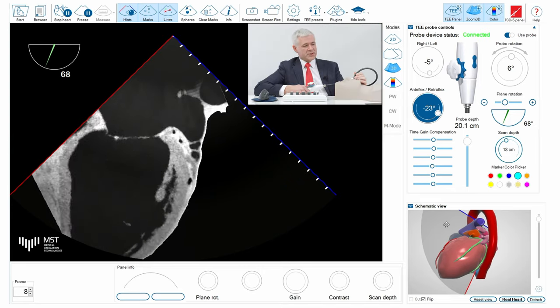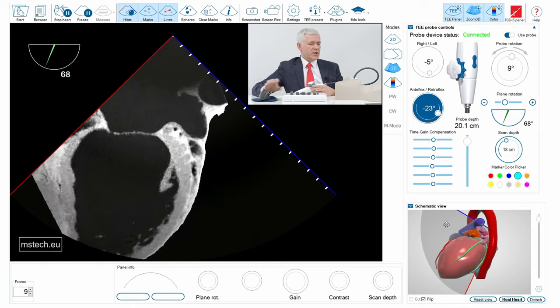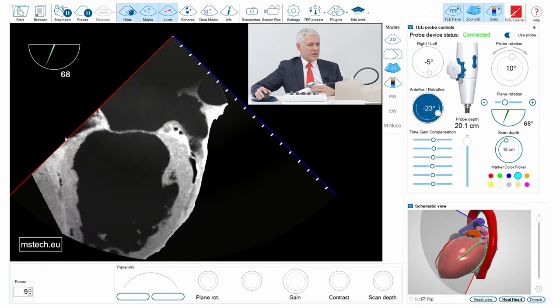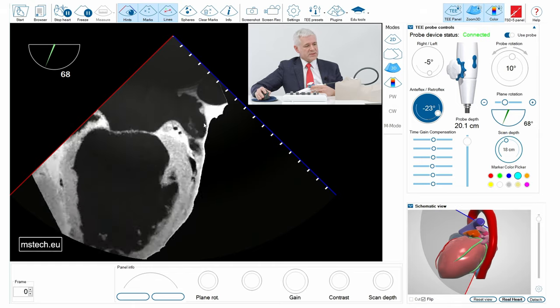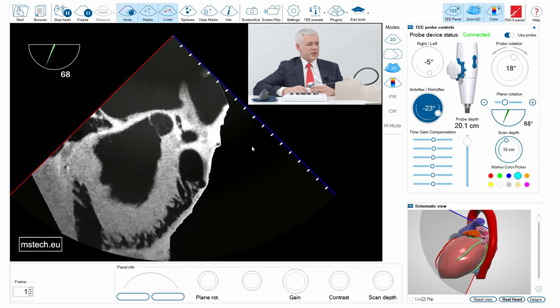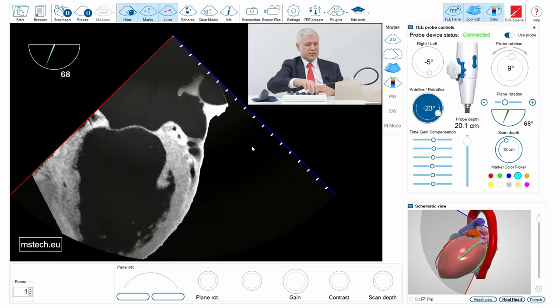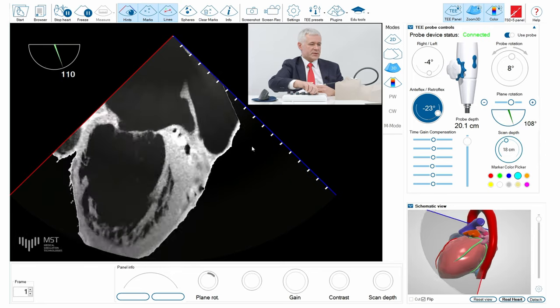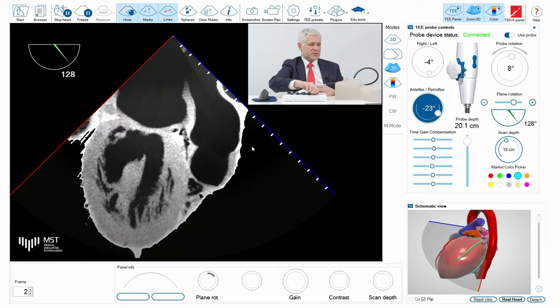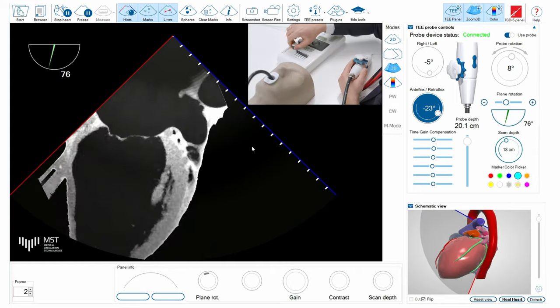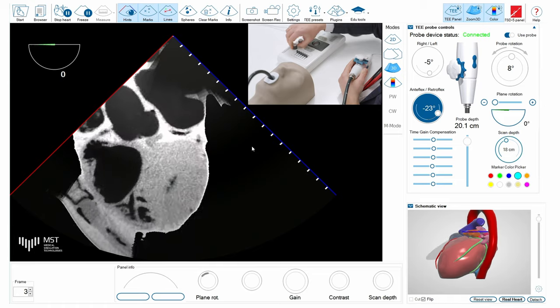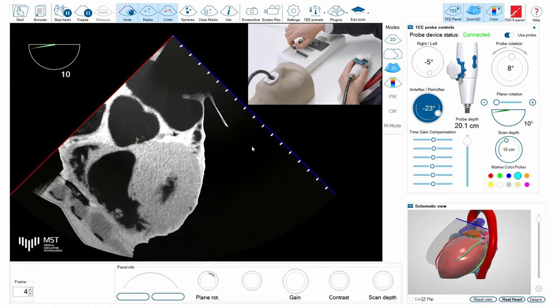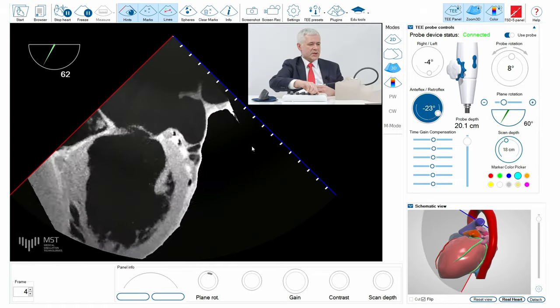However, you can see that there is a Coumadin ridge which can create artifacts in the left atrial appendage, and also we cannot really measure the orifice of the atrium because if I scan it with the angles from 0 to 120 degrees, I see that sometimes the appendage disappears from my view.